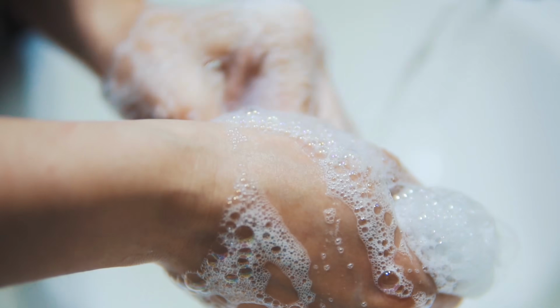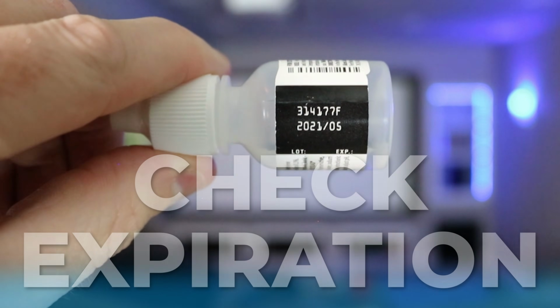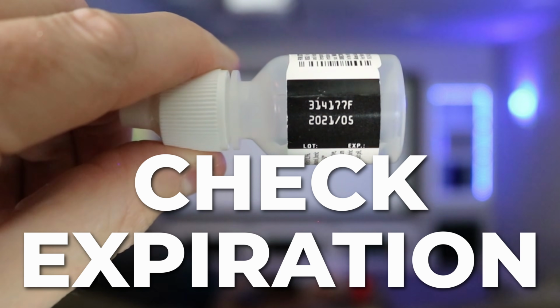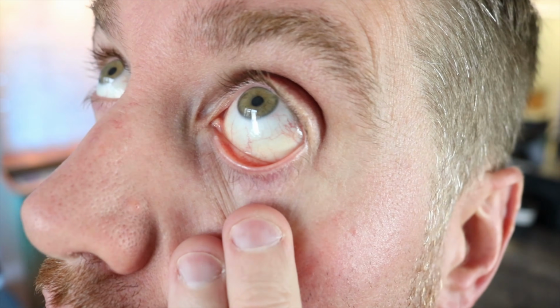First things first is you want to prep properly. You will be touching your eye, so you want to make this process as clean and safe as possible. So don't ignore these steps. Try and do this as best as you can. So once you're ready to put the eye drop in, you put the eye drops in your dominant hand, and with your non-dominant hand, you're going to pull down your lower eyelid to create this little pocket. And that eyelid pocket is going to be what's going to catch the eye drop.